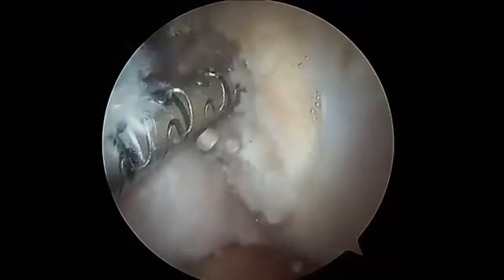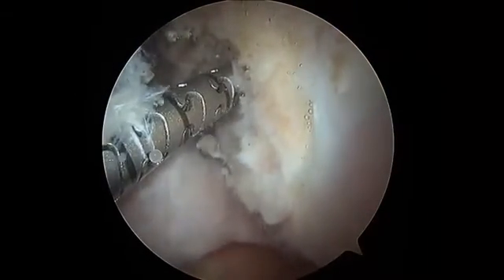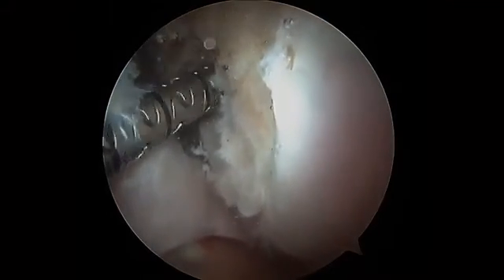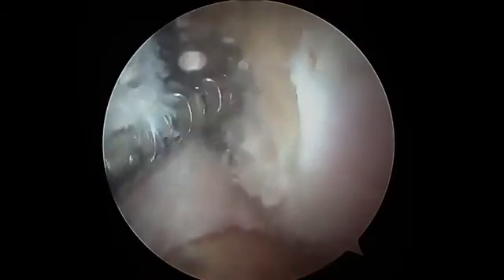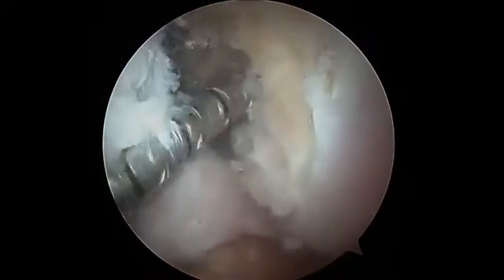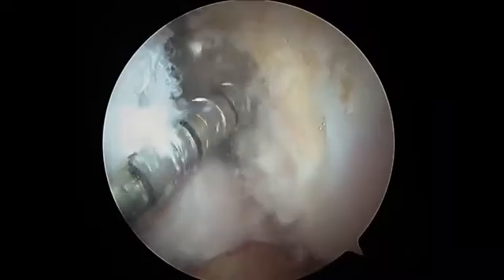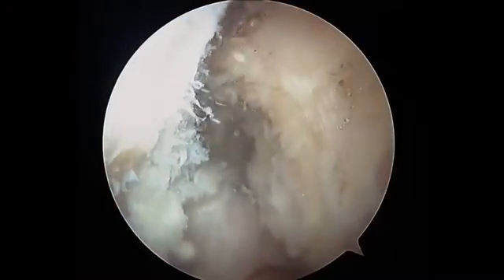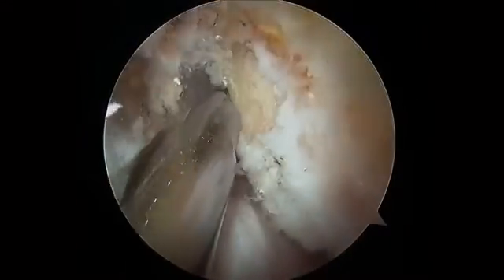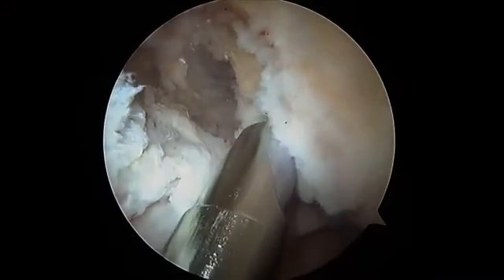And it feels like I'm at the cortex here. This should be 35 here. Going through the cortex. At about 38. So what you see here is a beautiful tunnel. There's a millimeter back wall.